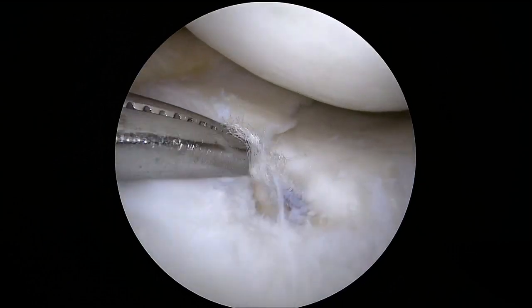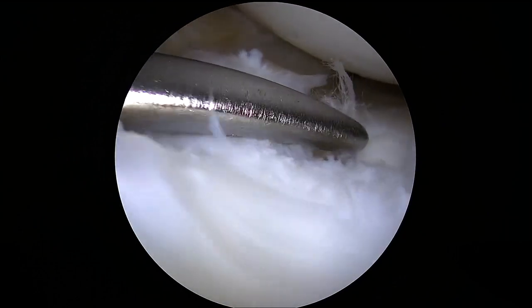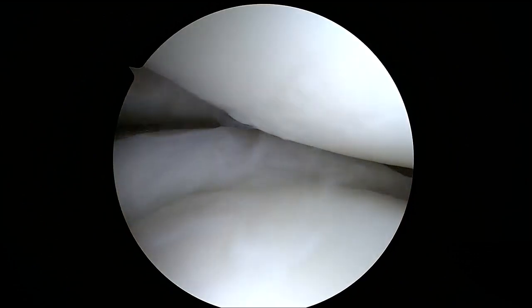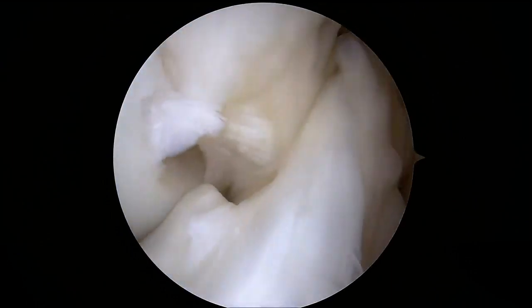The patient is positioned supine on the operating table and medial and lateral arthroscopic portals are made. Arthroscopy is performed to evaluate intra-articular structures. The lateral and medial compartments, as well as the anterior and posterior cruciate ligaments, are assessed.